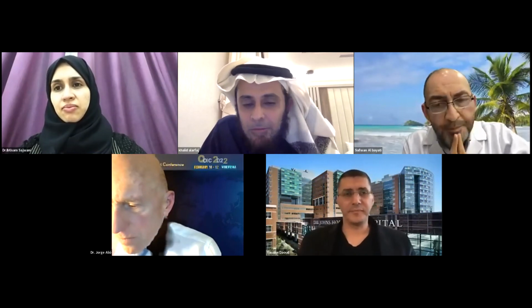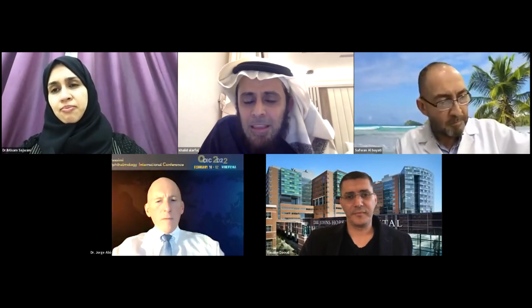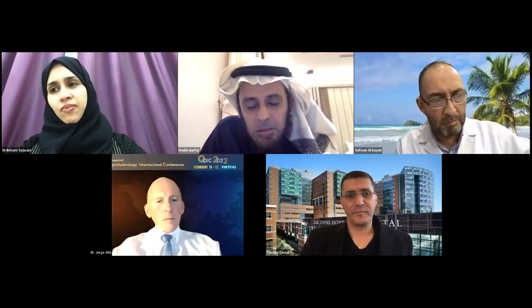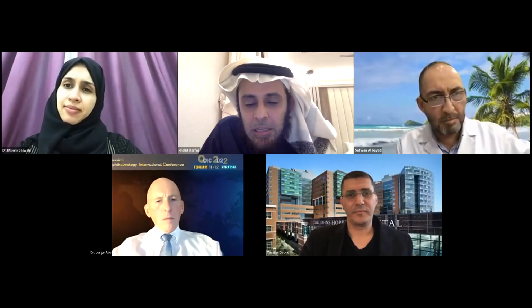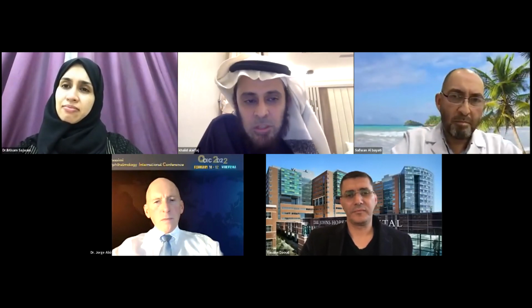Thank you so much, Dr. Sofon. I really enjoyed your talk and your very informative questions and comments. I have very limited experience with EDOF generally. Lucidus is also limited to 6 or 7 cases. They actually give intermediate vision much more than near vision. Most of my patients needed reading glasses to have good vision.